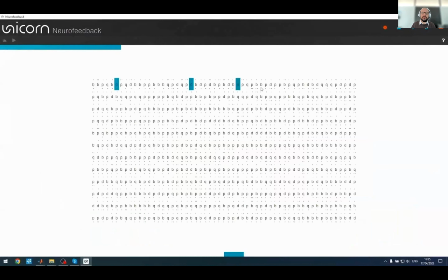So everyone is using the 8-channel montage, mostly on the occipital area, because then we can detect much better the alpha activity when they are resting versus their cognitive load when they are performing the tasks, and we will be able to discern how engaged everyone is.